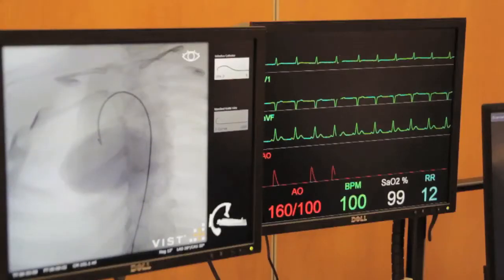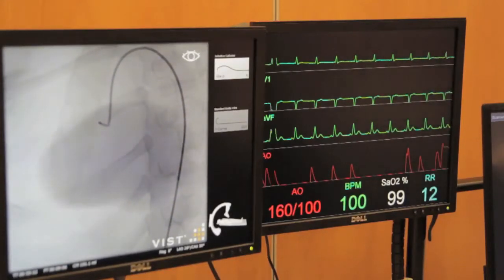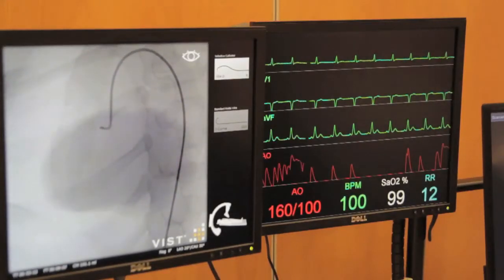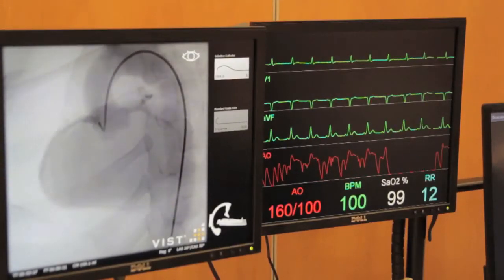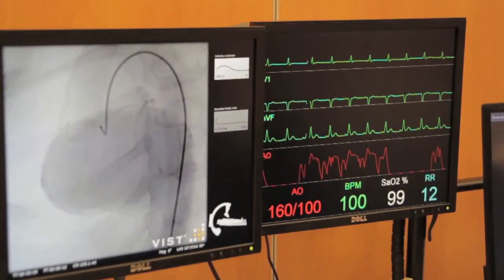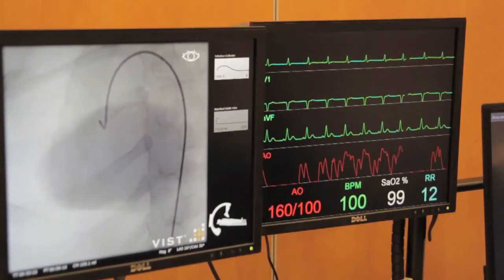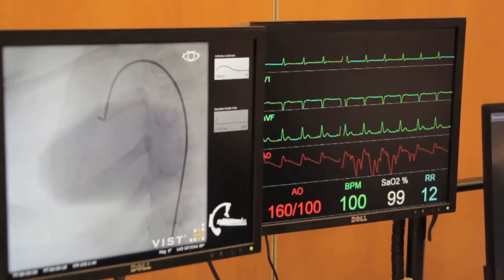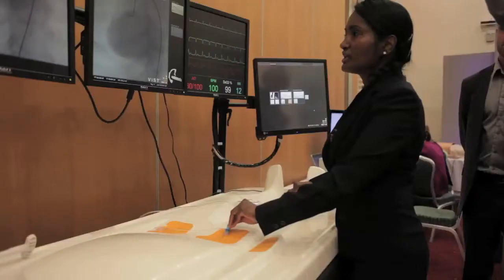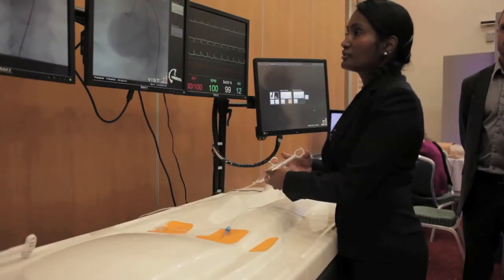You can see the left coronary artery arising from the left coronary sinus, but you can also see a shadow of the right coronary sinus coming, which will give you an idea where to aim for when you are trying to engage into the coronary artery. We now see that the catheter is not quite within the right coronary artery, so you do a gentle manipulation in order to get it into the right coronary artery.